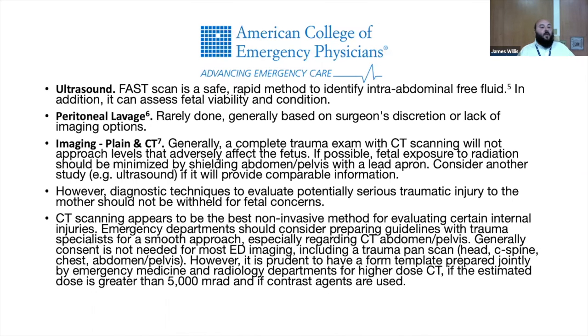ACEP weighs in as well with similar recommendations, saying that the FAST scan is fast and safe. You should initially screen trauma patients, no matter what the demographic, first with the FAST exam. However, if your clinical suspicion is high, then you should be performing a CT scan regardless of the radiation.